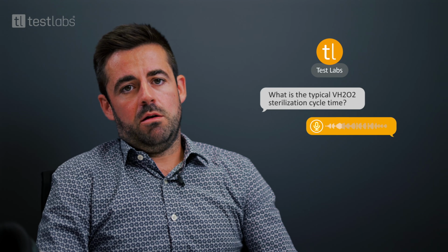This is our typical cycle duration. To date, we have been designing cycles, and let's say the fastest one is around 20 to 24 minutes, and the longest we have had, for a very challenging medical device, is 6 hours. So thank you. That's it from my side. I've been pressure tested. I hope this helps to get some clarity and understanding of the VH2O2 sterilization process.